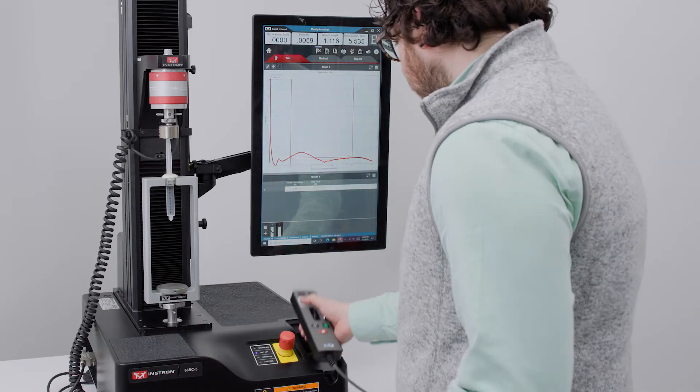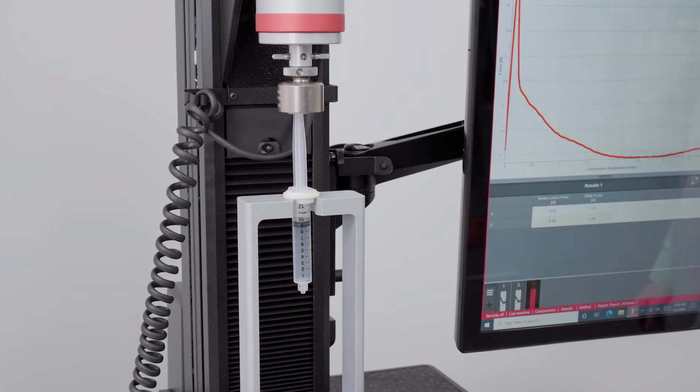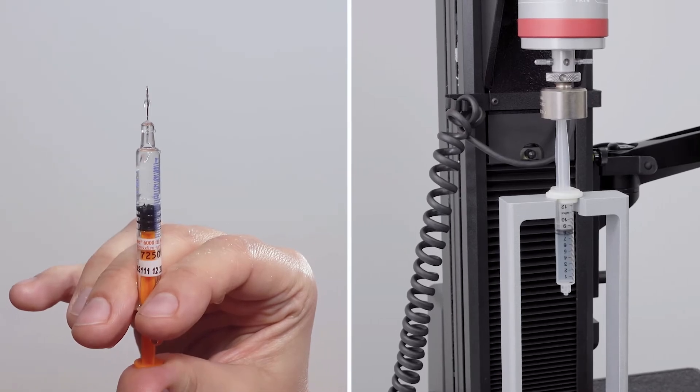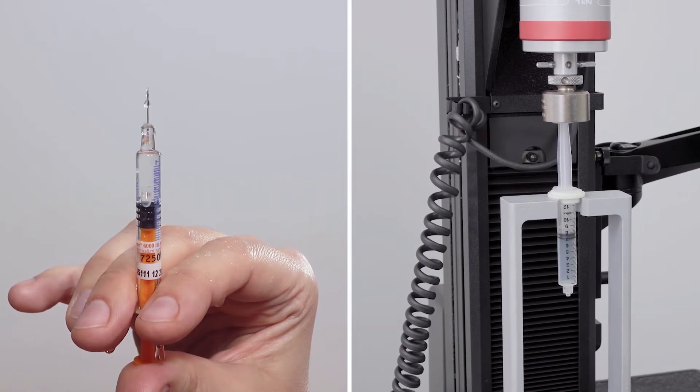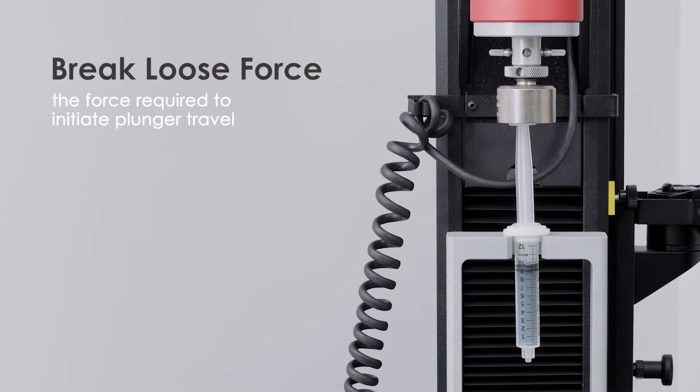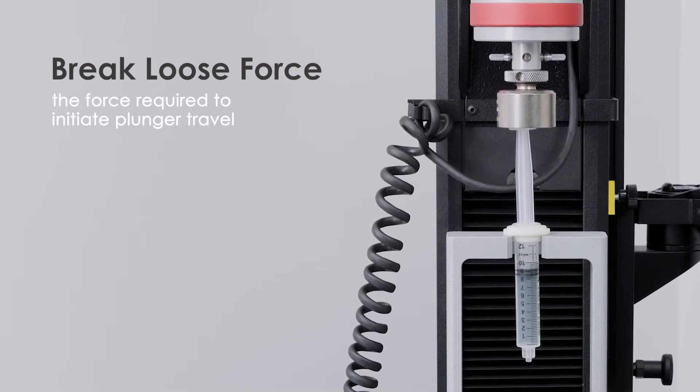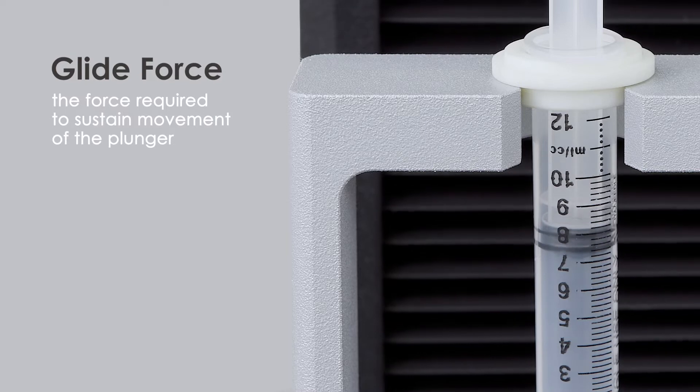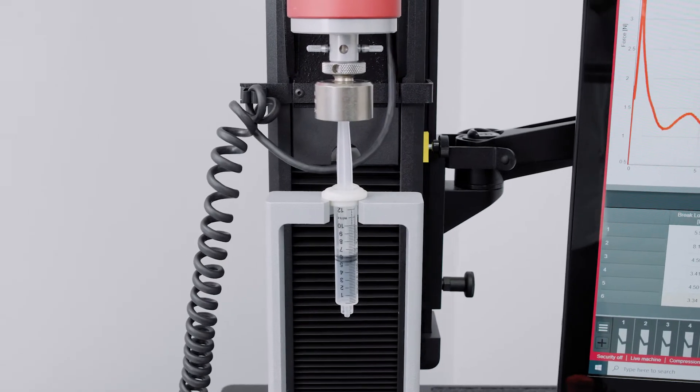Break loose and glide force testing is the most fundamental type of mechanical test that must be performed on all syringes. This test simulates the real-world use of the device in order to quantify the break loose force, or the force required to initiate plunger travel, and the glide force, or the force required to sustain movement of the plunger.